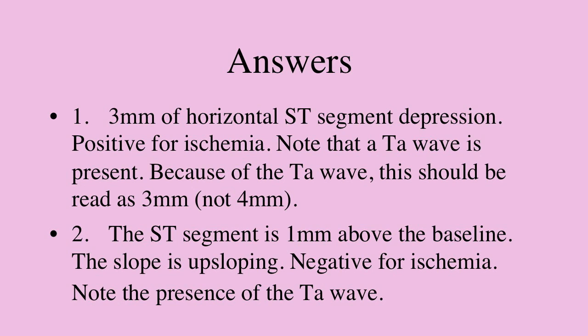This is a person that, with a lack of QT interval shortening, ended up having single vessel disease and had a catheterization and had a balloon put in, or angioplasty with a stent, and it corrected it. So again, the QT interval should not stay the same or lengthen with exercise.